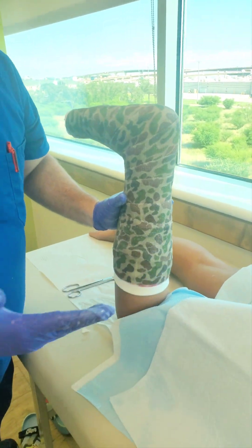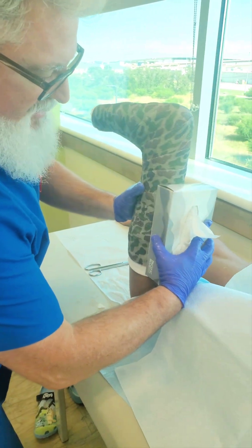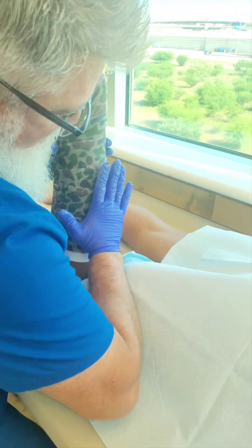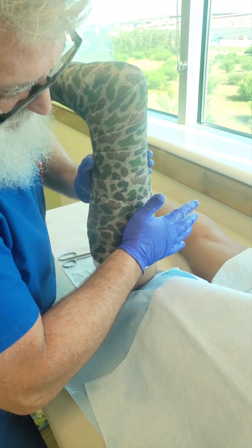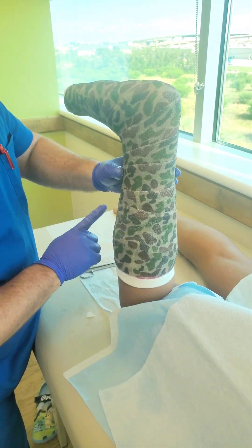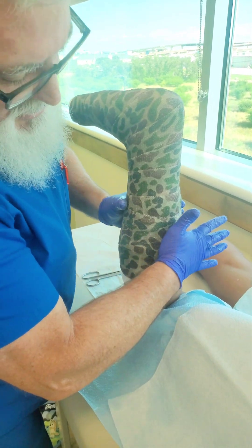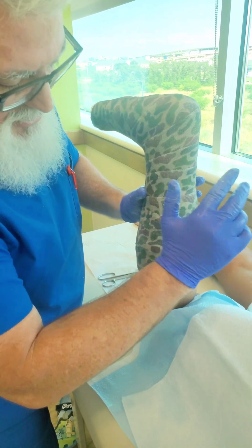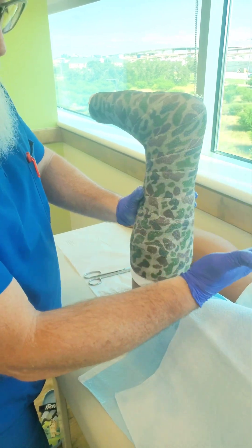The next mold is called the gastrocnemius mold. Some people do it with the flat of their hand, some people use the back of a box. What you do is make the back of the cast flat — just flat like a board. That's all you're doing. You can incorporate two molds at the same time, which brings me to the triangle or pyramid mold that goes right above the center tibia, but let's start with just the nice flat gastroc mold first.